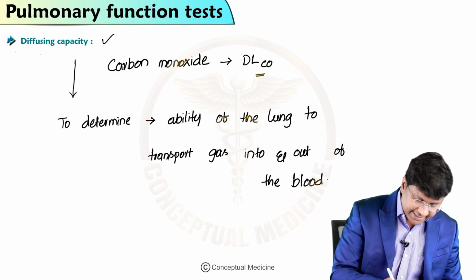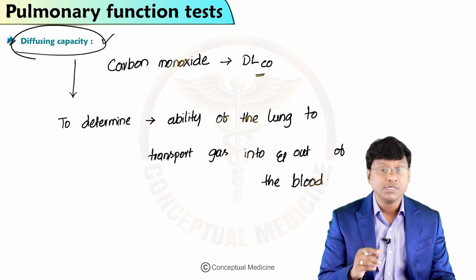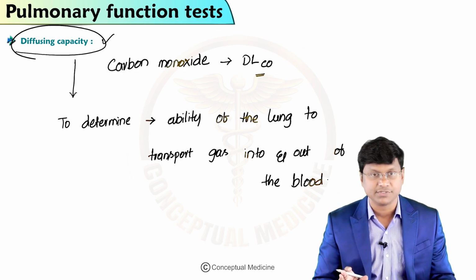And for that we use carbon monoxide in order to assess how the diffusion capacity is within the individual.